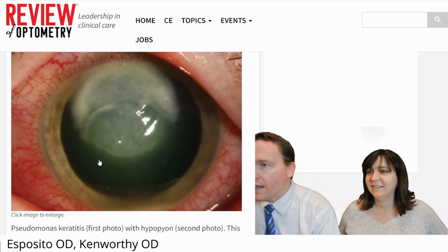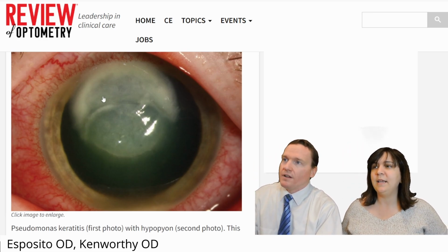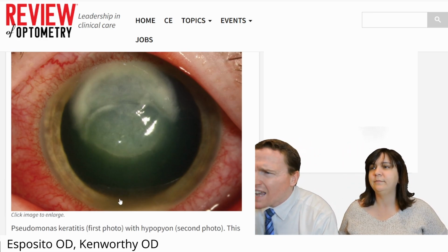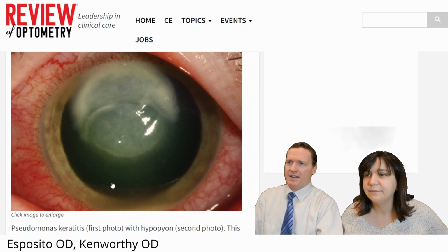Oh, look at this. Oh, they waited. Ooh, what is that? Oh, it's just terrible. It's awful. Does that patient have a hypopyon? Well, it's kind of hard to see in that photograph, but way down at the bottom I see a little hypopyon. Yeah, definitely.